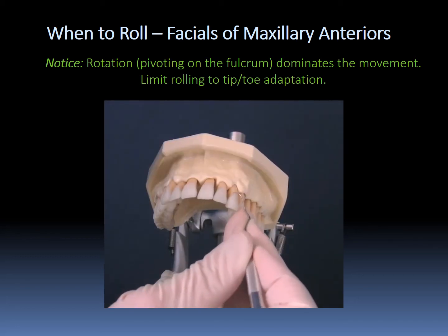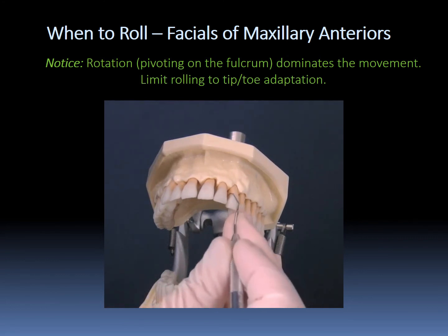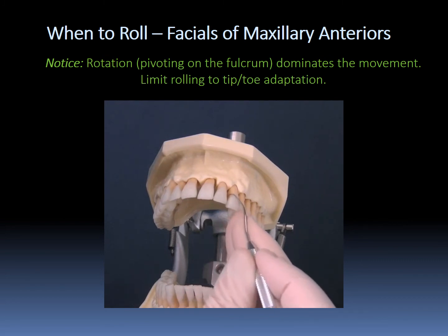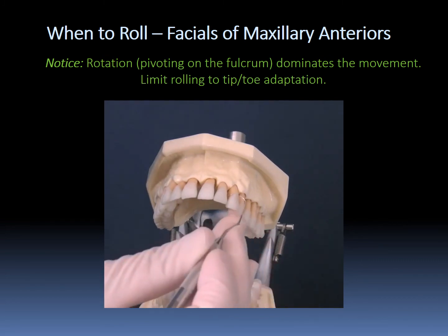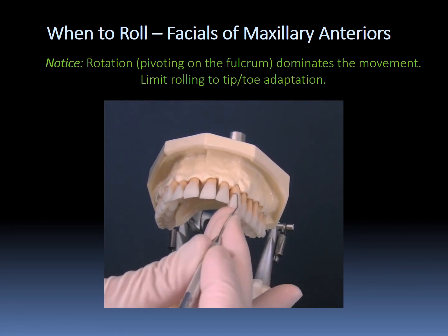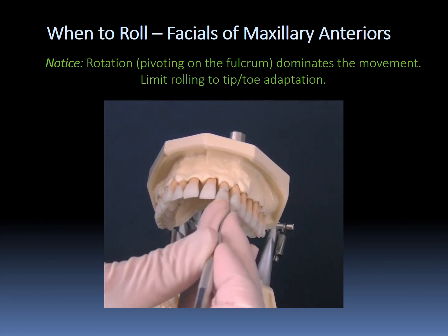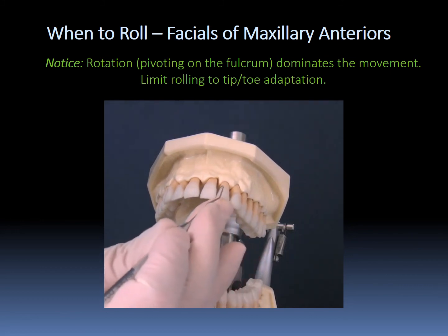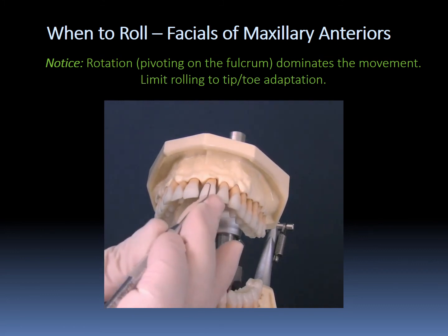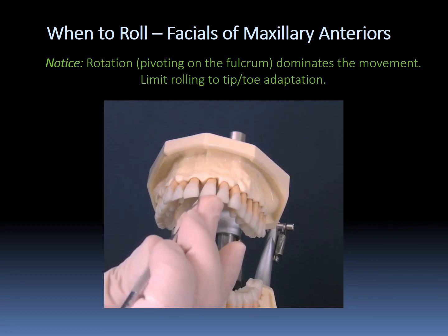Explorer here on the facial of the left canine, and then I rotate around. Now right here, if I stay with my fulcrum in this position, I'm going to cross over very severely across this mesial surface. So you want to drop your handle and upright your lower shank first, then rotate around, and then keep this lower shank really parallel to the surface that you're exploring. So we're going to move the handle over toward our body as we do this to rotate this lower shank, or keep it over so that it will stay parallel to these mesial surfaces.